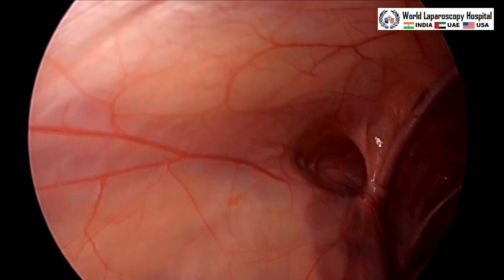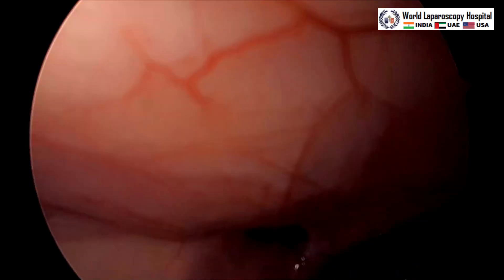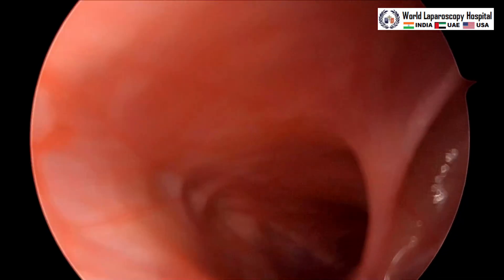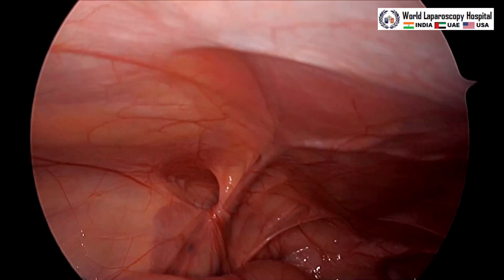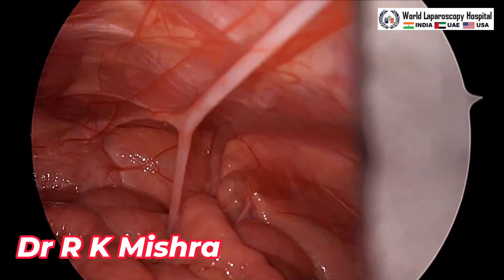First we will start with the diagnostic view. We can see here is the left-side indirect inguinal hernia — this is the hernia. In this patient, the right side is normal and has no hernia.